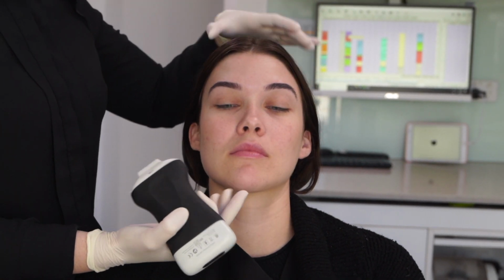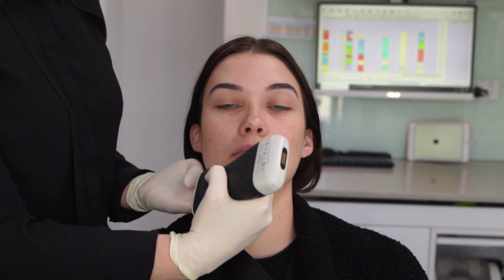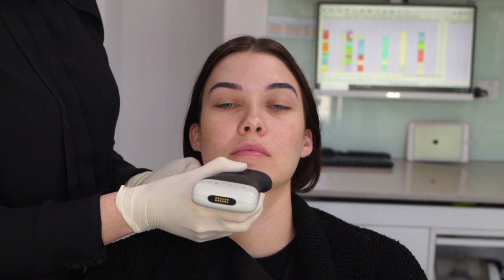Next, we move to the chin and lower lip, starting with the reference point of the depressor anguli oris muscle. The artery to be found in this position is the inferior labial artery.